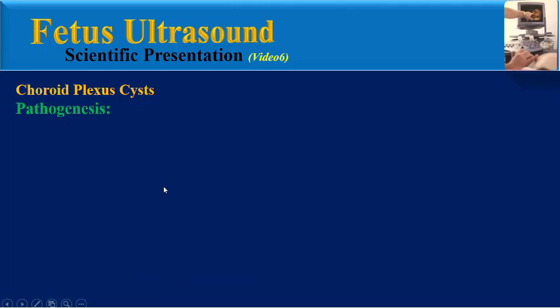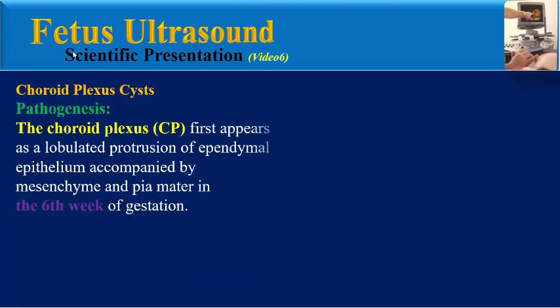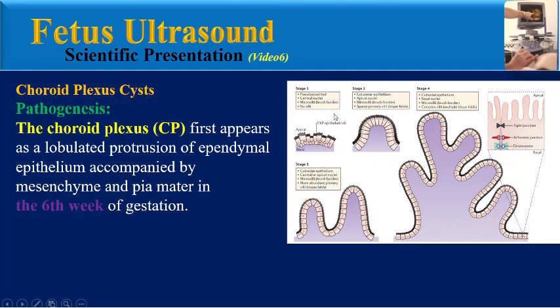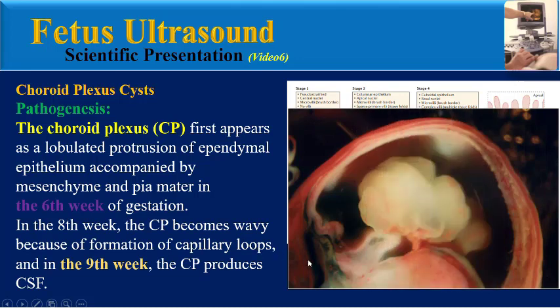What is the pathogenesis of this cyst? The choroid plexus first appears as a lobulated protrusion of ependymal epithelium accompanied by mesenchyma and pia mater at six weeks of gestation. In the eighth week, the choroid plexus becomes wavy because of formation of capillary loops, and in the ninth week, the choroid plexus produces CSF.